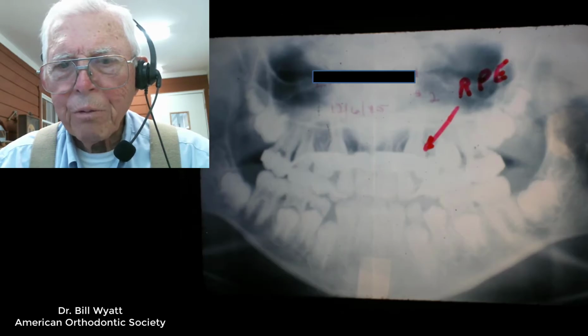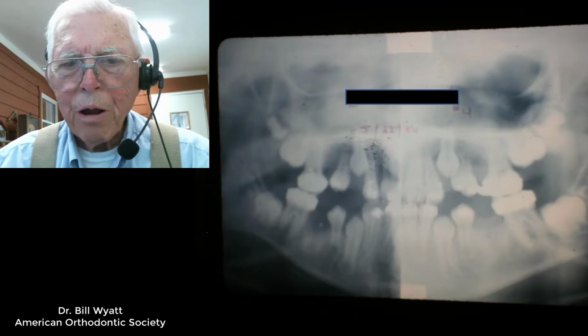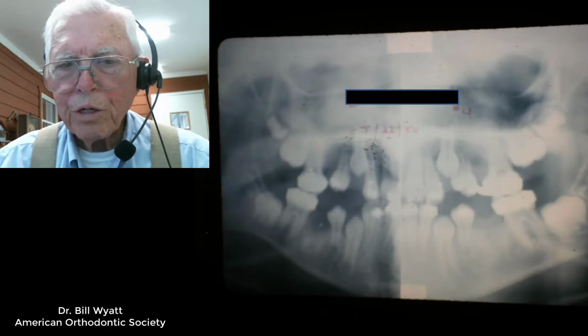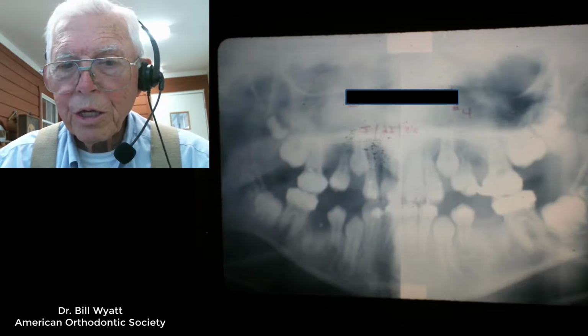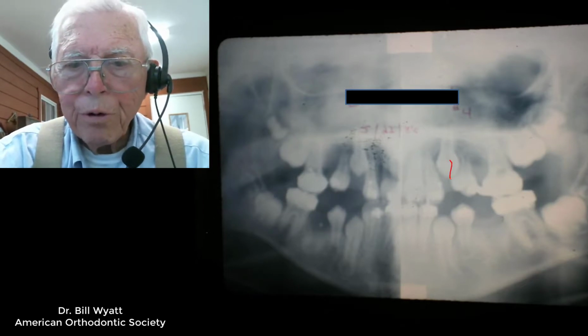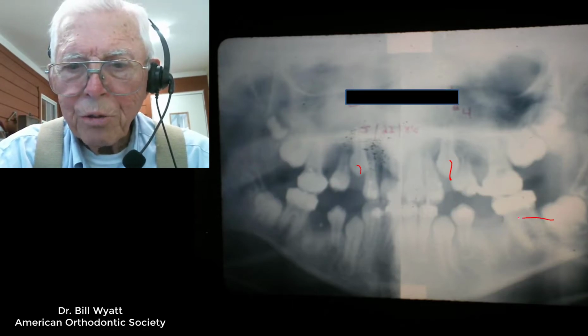All right, here we just show the x-rays. We took out the second bicuspids. The upper cuspids were extremely crowded, and that's going to help us. So you can see we marked these off, but that was prior to when we separated the palate. But you can see the cuspids now have got a pretty good place to come into in the mouth, and these teeth will move forward in this. This will come back some.